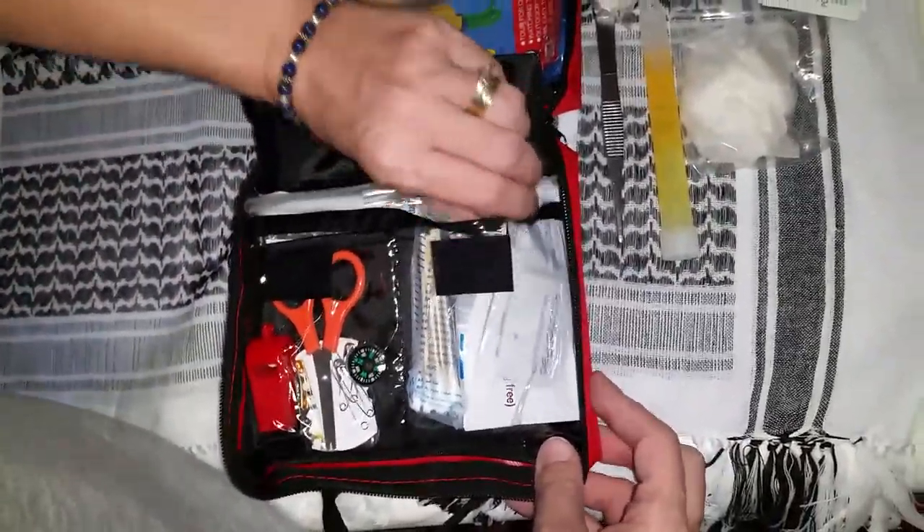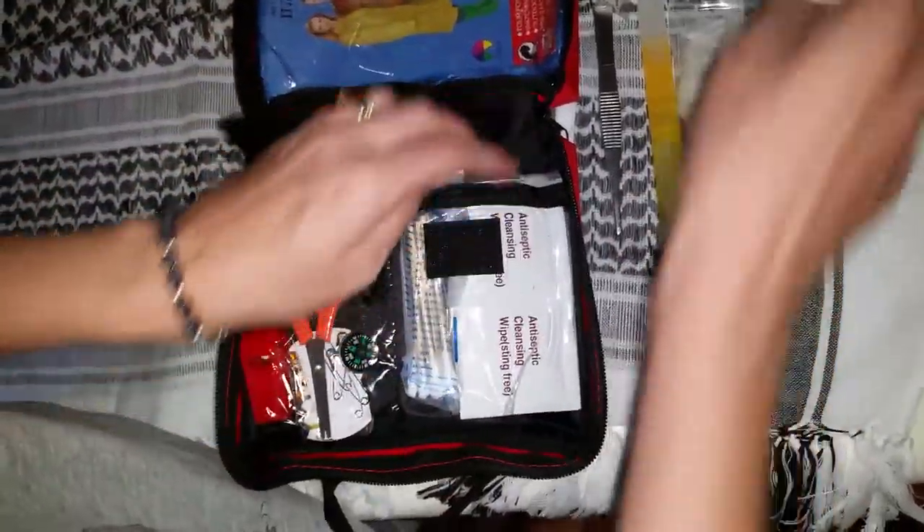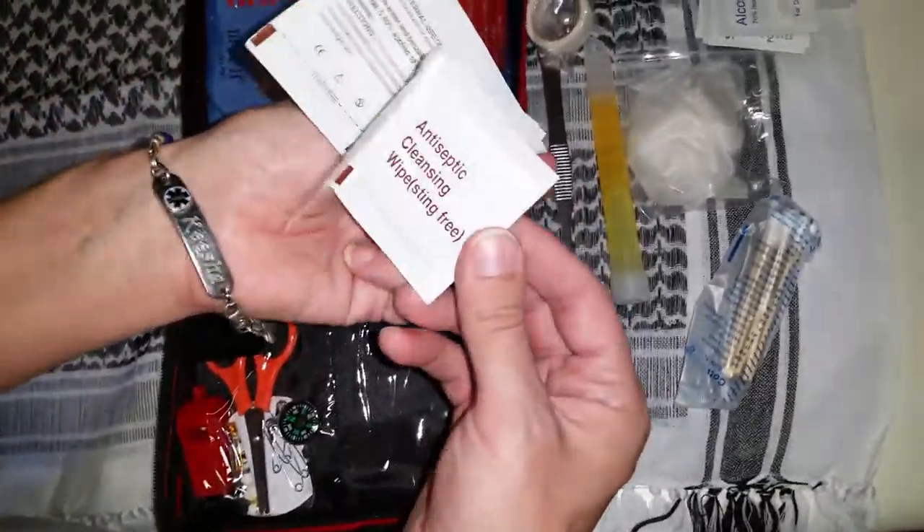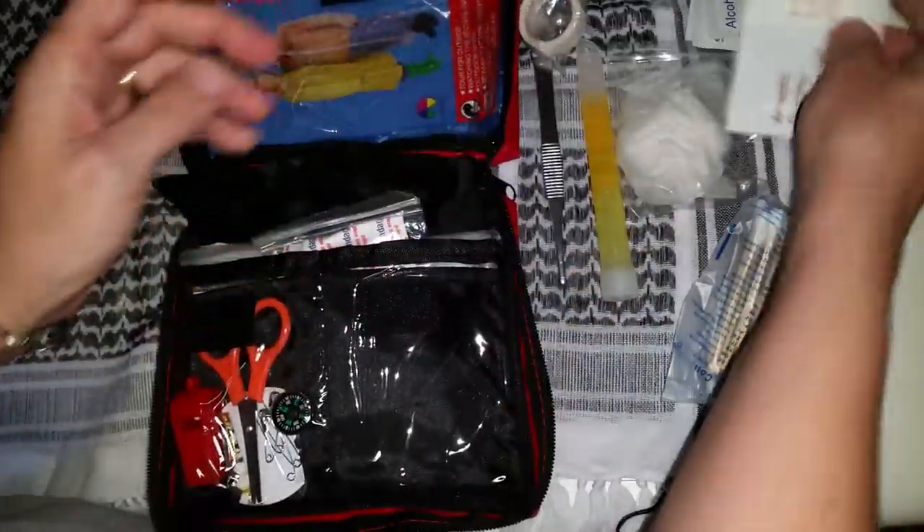Cotton swab q-tips. Antiseptic wipes — they don't hold back on you, there's a lot of them in here.